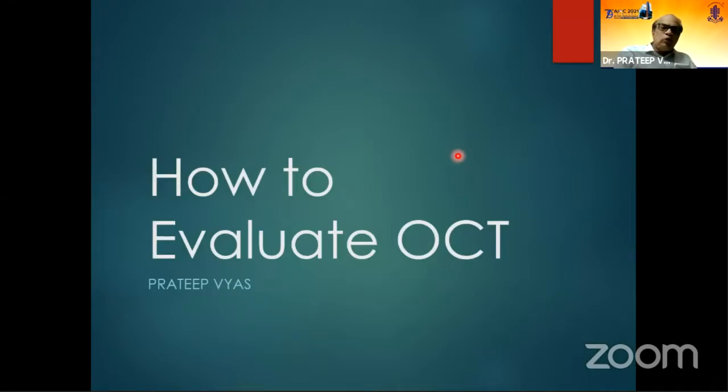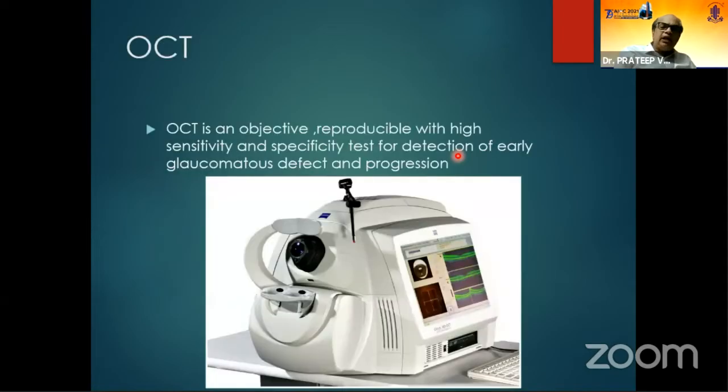And my two previous speakers, Dr. Preeti and Dr. Subhadra, taught us the perimetry and how to evaluate the test and the RNFL. Yes, I do agree with Dr. Subhadra that perimetry is the gold standard, but structural damage always precedes the functional loss. We see the perimetry changes only when 30 to 40% of ganglion cells are lost. Dr. Preeti taught us beautifully how to examine the test and the RNFL.